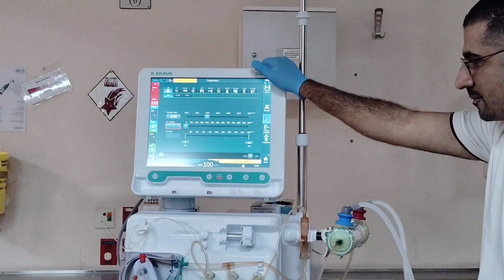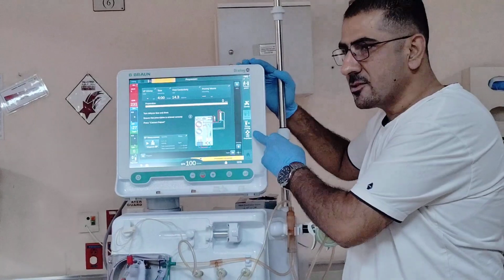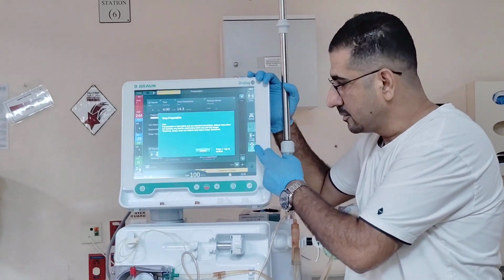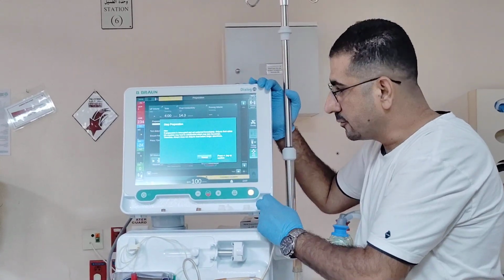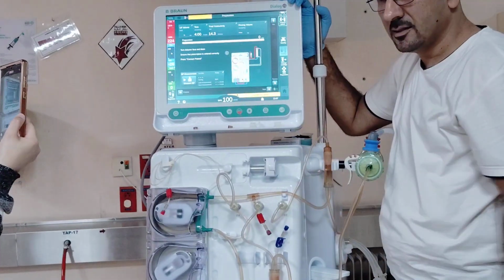Now, at any time you can stop the therapy from here. By pressing here, again you will get a second confirmation message: are you sure you want to stop, or cancel?